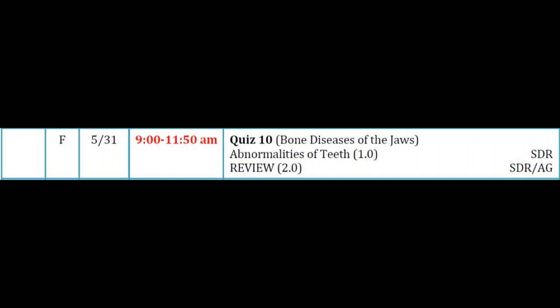So some kids get lucky and some don't. And this is the radiograph for that child, and you can see the fusion, one root, and the fusion line separating crowns: cuspid, lateral fused with central, lateral fused with central, cuspid. Does it persist into the permanent teeth? Yes, it does, because that's a cuspid. These are the only two incisors, and that's a cuspid. So yes, it did persist for that patient.